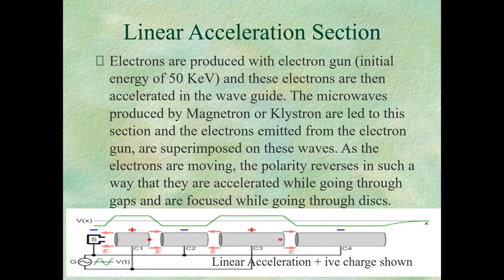The X-ray beam is a transmission type, as the electrons are incident on one side of the target and the X-rays are produced on the other side. It's forward peaking. The electron energy is converted into a spectrum of X-rays. So the X-ray beam that is generated is not mono-energetic. It's actually a spectrum of energies from zero all the way to the max energy of the electrons.